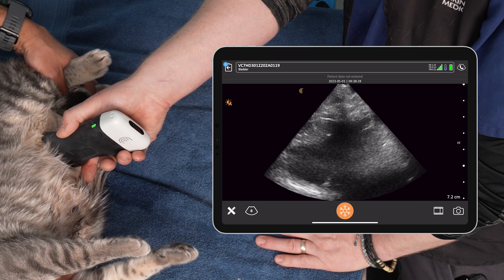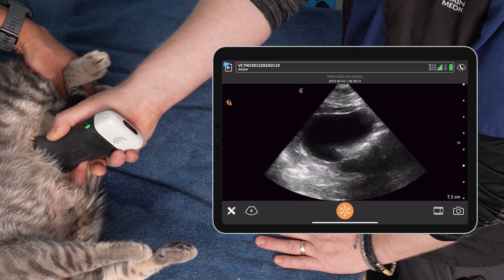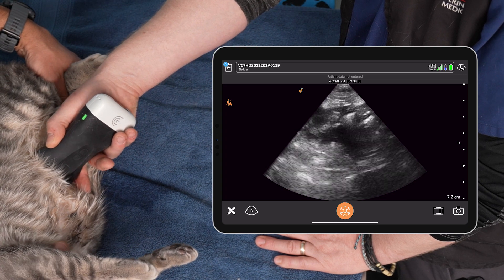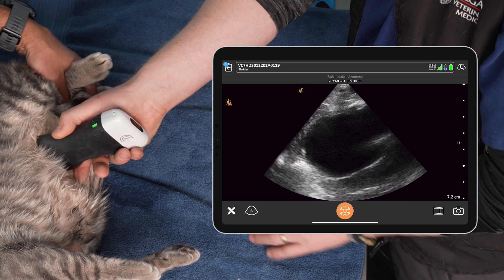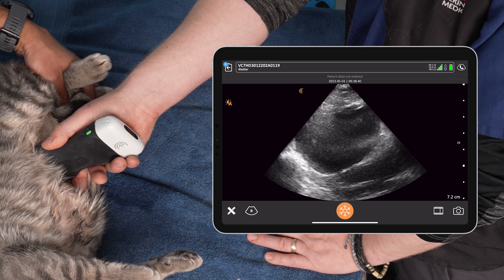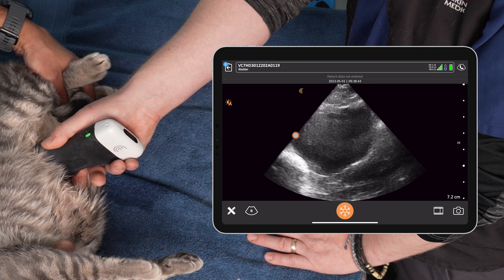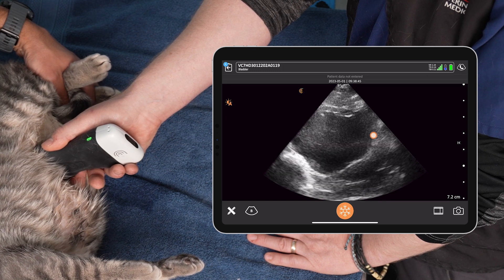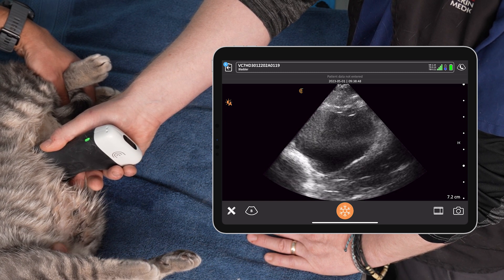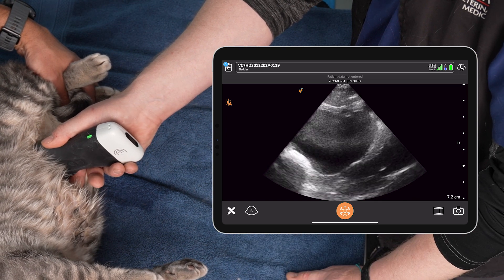Once we've completed long axis, we rotate into short axis and, depending on the size of the bladder, we fan and/or sweep to cover all planes when looking for free fluid. Then we come back and find the urinary bladder at its widest point in short axis, come in perpendicular, and take a measurement — this is for urinary bladder volume estimation, especially useful when measured serially over time.